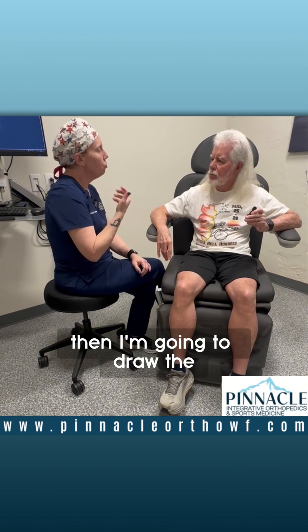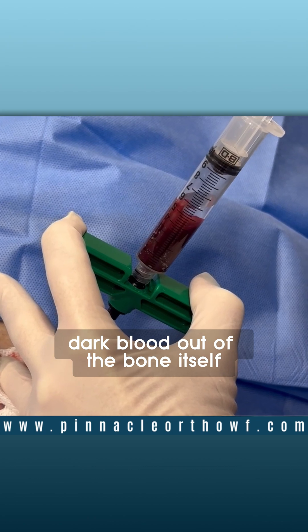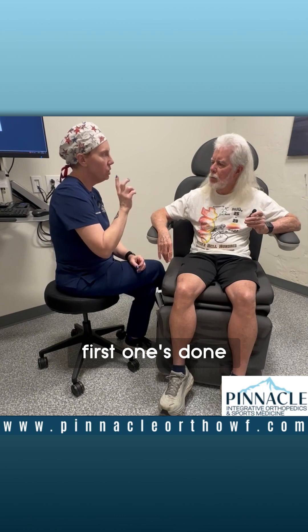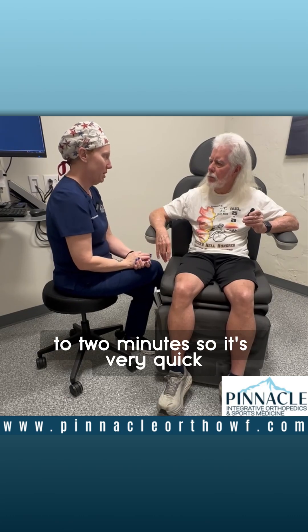Once I get in there, then I'm going to draw the bone marrow, which kind of looks like dark blood, out of the bone itself. I do six small tubes and I count down — first one's done, second one's done — so that you know where we are in the process. Everything goes right, it takes about a minute and a half to two minutes. So it's very quick.